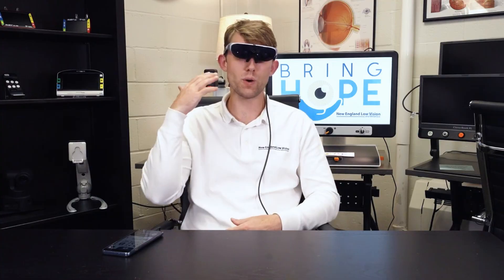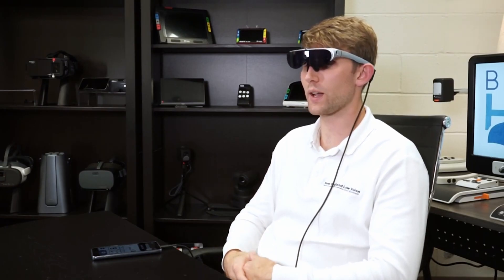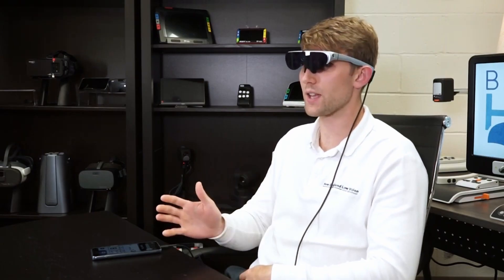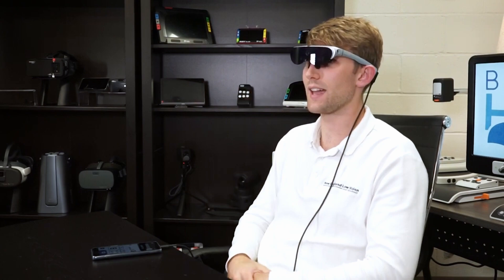Now going into the iDaptic i6 features — if you have an iDaptic i5, you can purchase an upgrade for your i5 into the i6. The i5 and the i6 have exactly the same hardware; it's just the added feature of having an AI assistant.